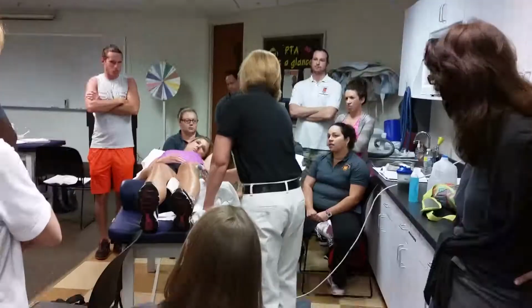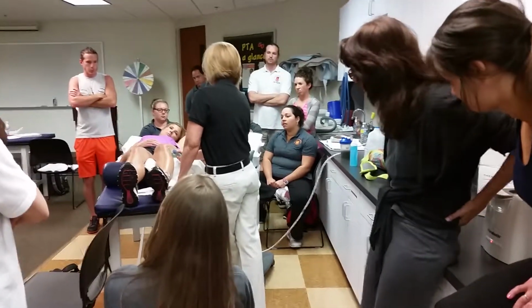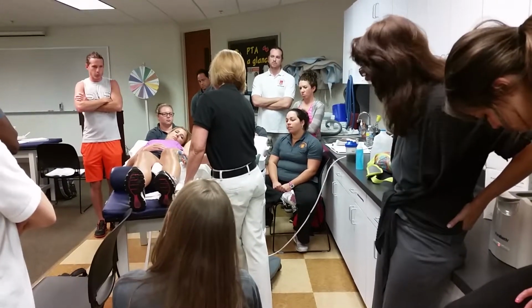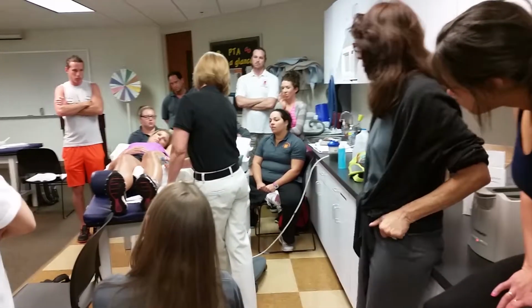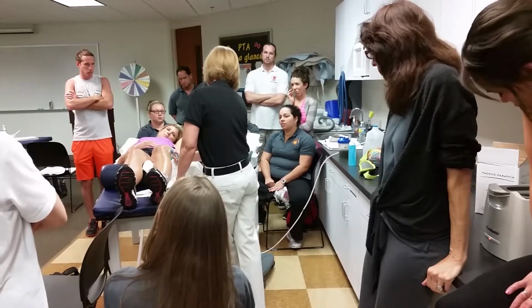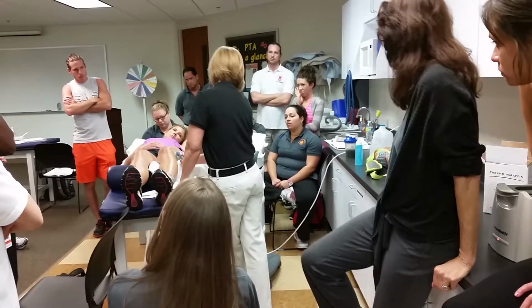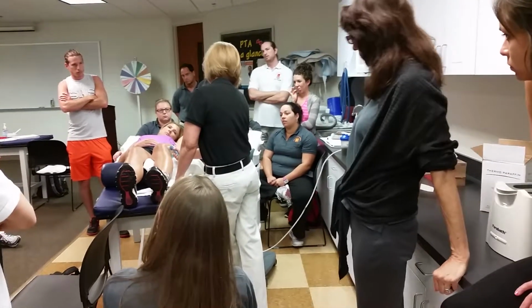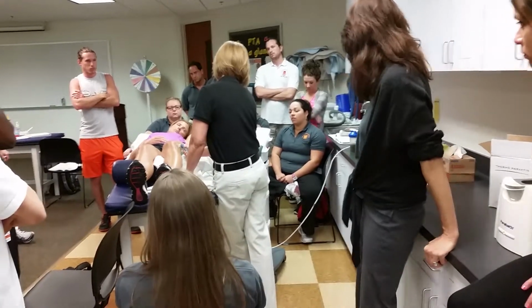You're putting some pressure as you're. Yeah, when I have done treatments on people, if I do it really right, I feel like that changes the contact, so I always put a little pressure on it. Not a lot, I'm not causing pain. I just want to make sure, because remember, the body is not a flat surface, it's rounded, and if I'm making light contact, there are literally areas that I could be lifting off the tissue, and then that changes the delivery.